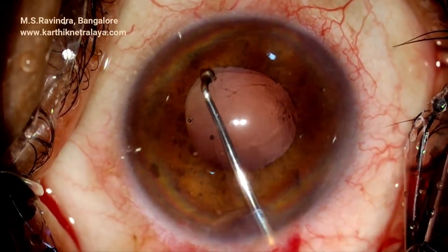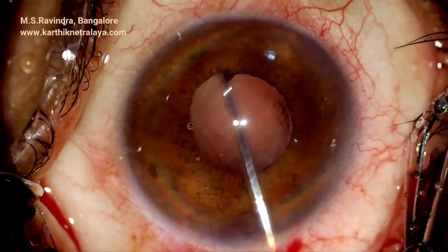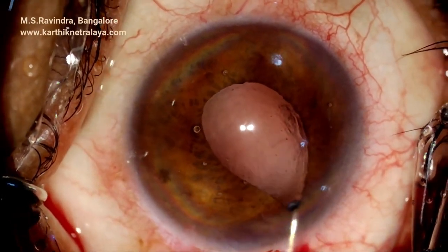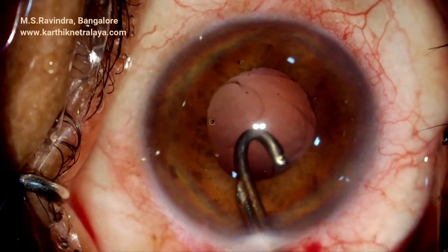Inspection of the capsular bag is done using a ball dialer. As you can see on the right lower side, there is a little bit of cortex, which is aspirated. A lens is then implanted in the capsular bag.